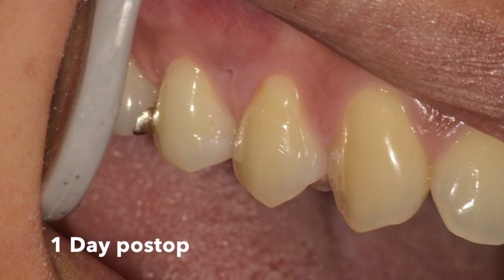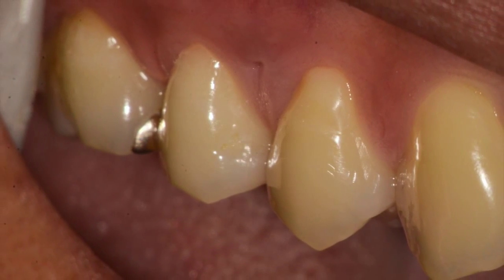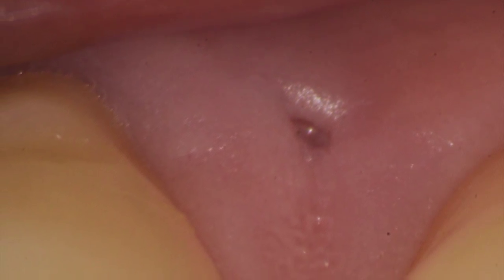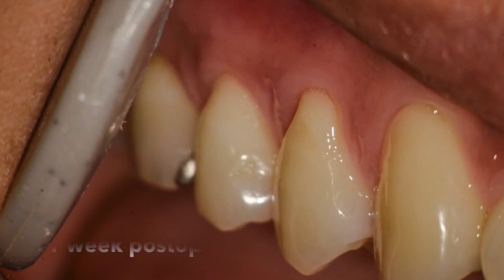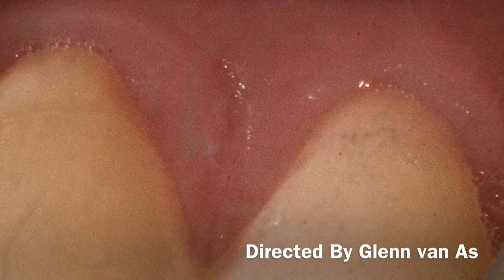One day healing shows a tremendous improvement — no pain, no analgesics were necessary. The one-week healing shown at the end here shows complete closure of the space, and you can see the one-week post-op and how the space is completely closed.